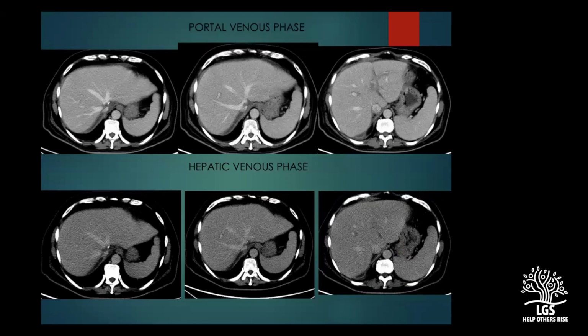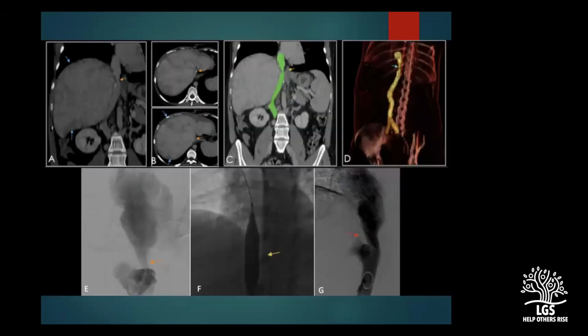So the most important thing in this context, when you see an ultrasound abnormality, is to make sure you do a CT scan and identify that, because CT can help in looking at the congestion of the liver. This is how the liver looks. It looks so congested. It's got this typical mosaic pattern, especially in Budd-Chiari patients. And what you're seeing is a very narrowed segment of the cava there.